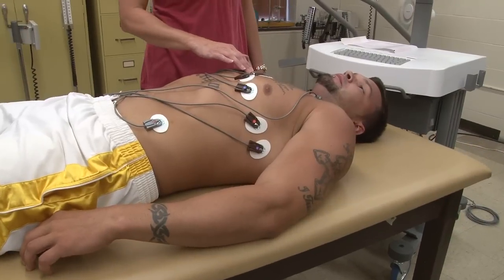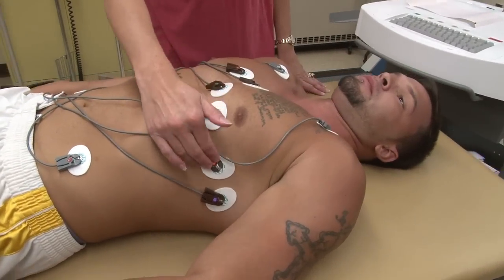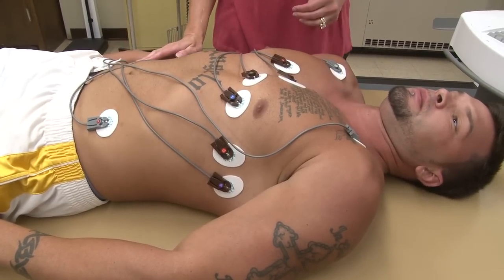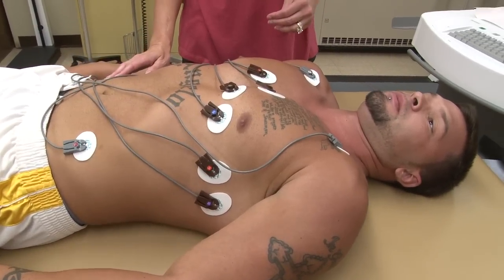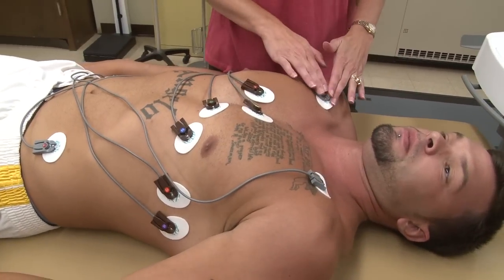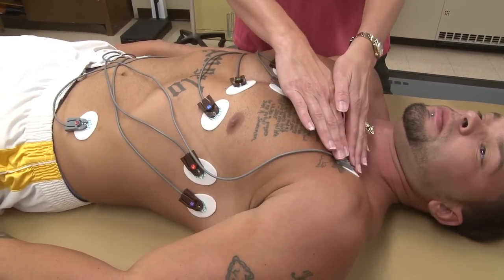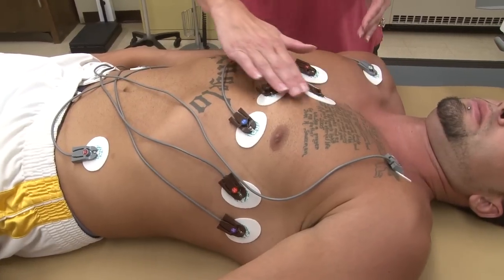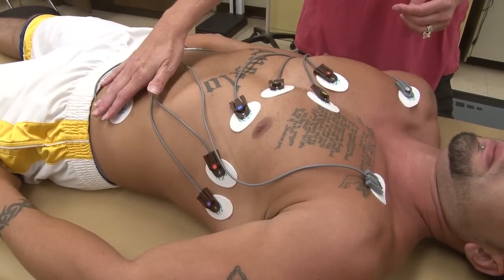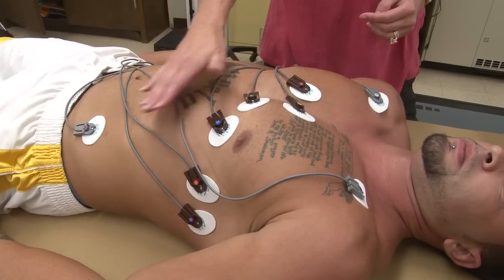Alright, so we have our 6 chest leads, or 6 precordial leads, and then we have 3 from our limb leads, knowing that this one is the ground. Our 3 from our limb leads are aVR, which is augmented voltage right, which comes from the right arm, aVL, which is augmented voltage left, which comes from the left arm, and aVF, which is augmented voltage foot, which comes from our foot that is not the ground.